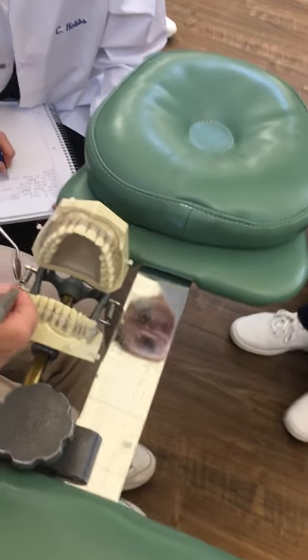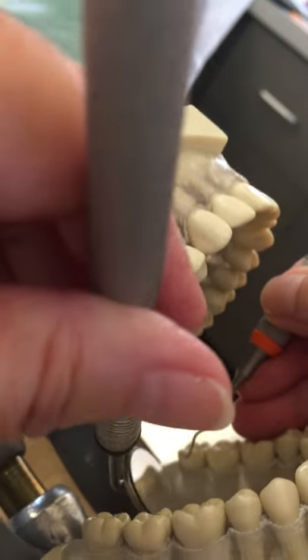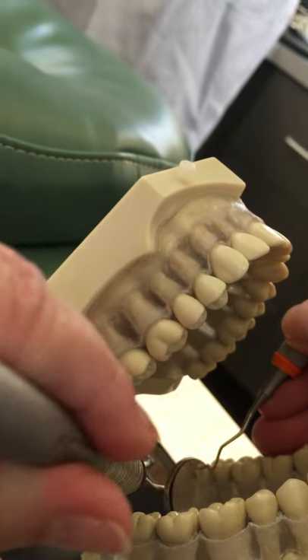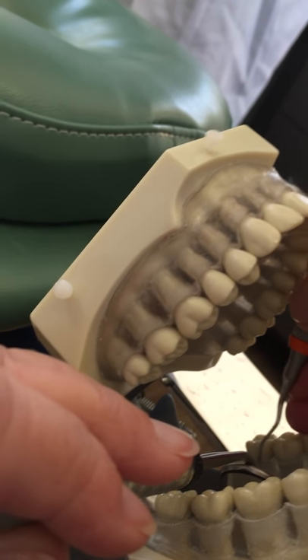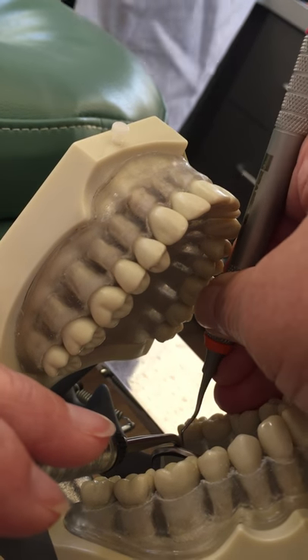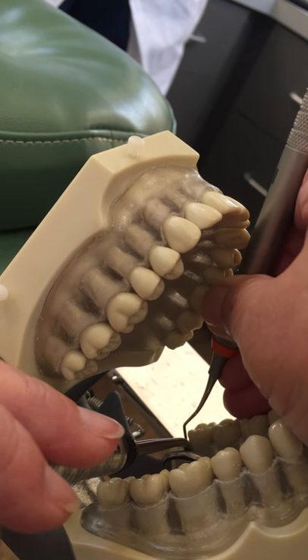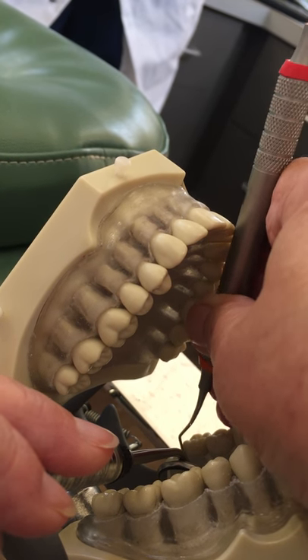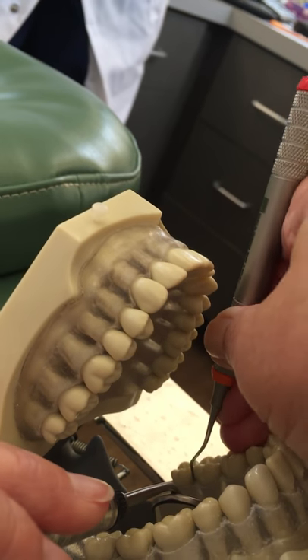For area 4, it's the mirror image of area 3, so I'm just going to move over. I'm going to use my mirror to illuminate, to retract the tongue, and to see around the distals as well. I'm going to go enclosed and then open. Remember, these mandibular teeth lean toward the lingual, so you have to as well — that's because of that rhomboid shape of the proximal surfaces.